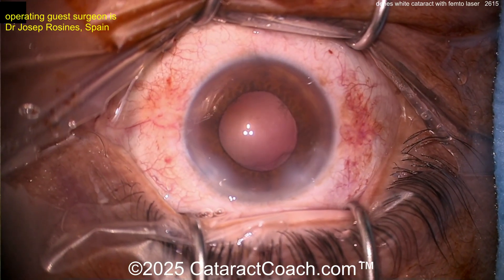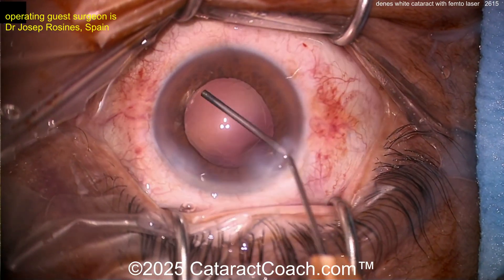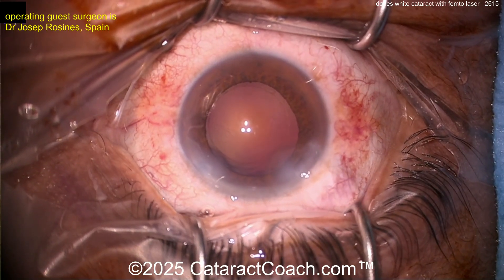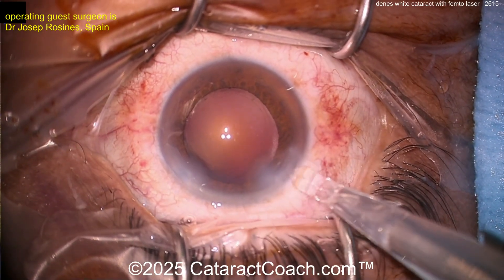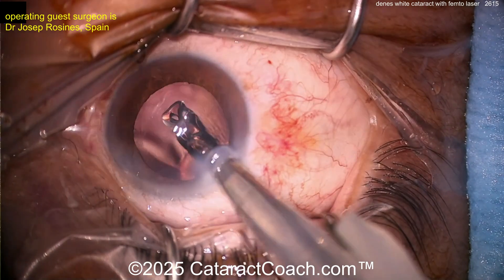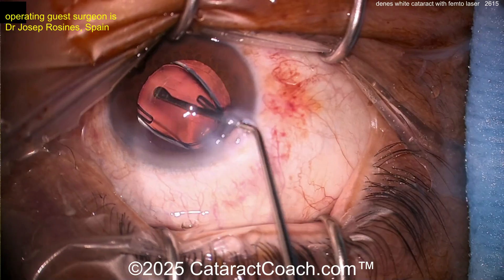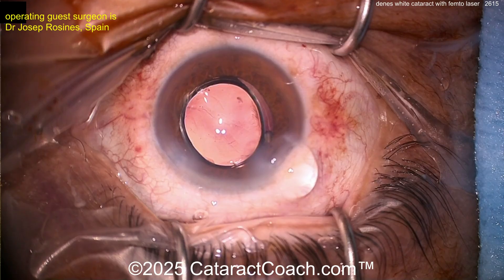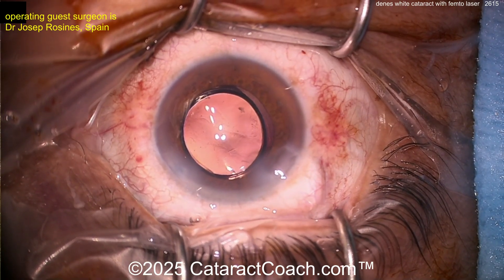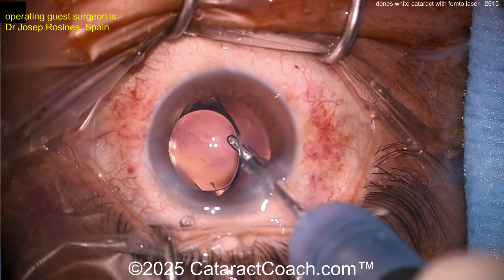Here's the end of the case — a little hydro polishing of the capsule, viscoelastic to fill the bag, and let's get the lens in. What an incredible result for this patient — vision completely restored. Here comes the lens — looks like a single-piece acrylic monofocal non-toric lens. Get that into the capsular bag and rotated around very nicely done. Remove the viscoelastic and that's a beautiful case.